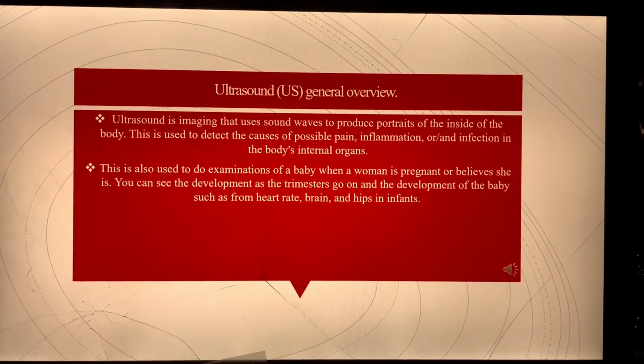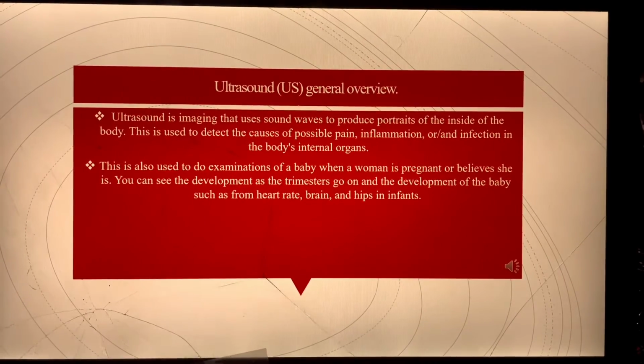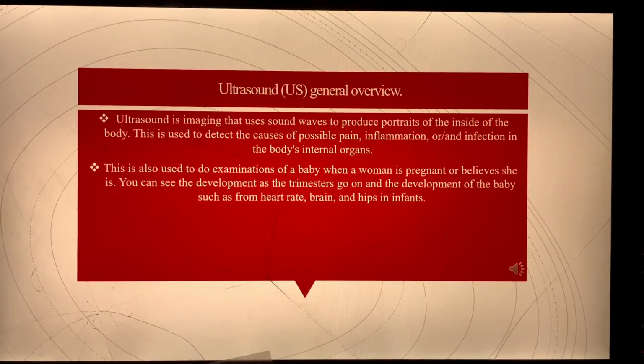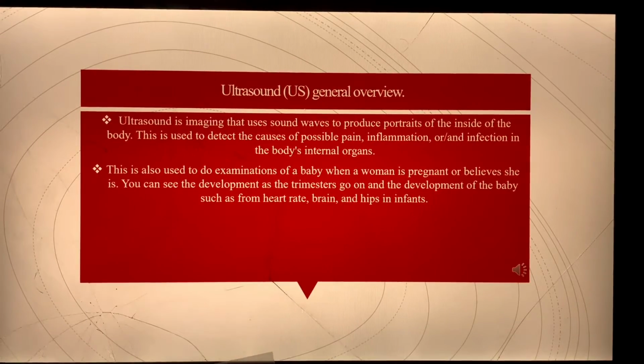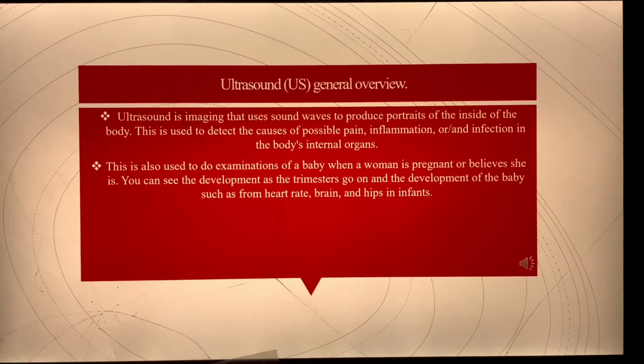So to begin my project, I'm going to start with what exactly is ultrasound and the general overall view of ultrasound. So ultrasound is imaging that uses sound waves to produce images of the inside of the body.